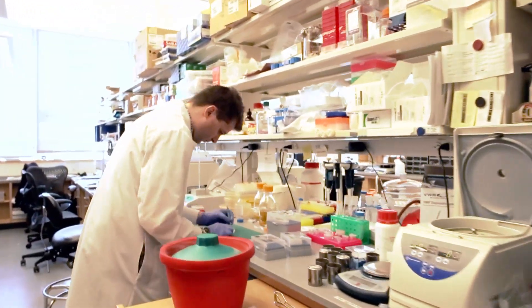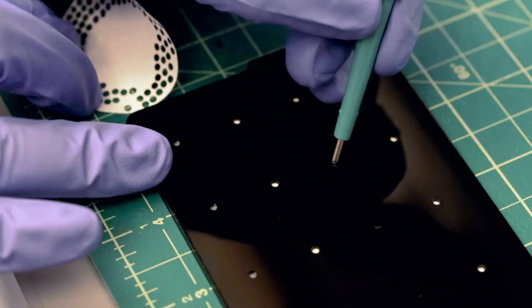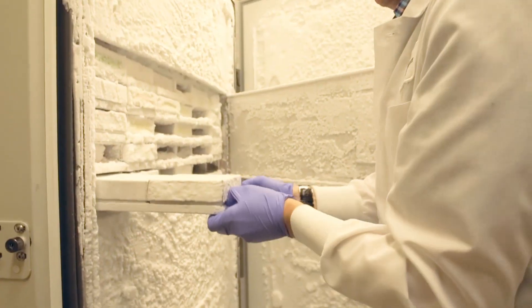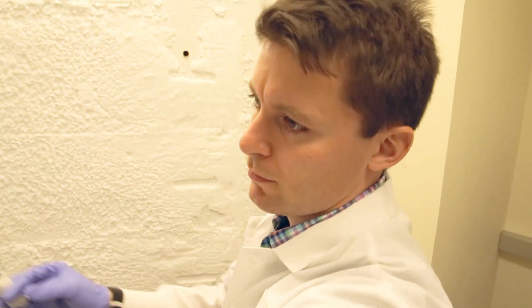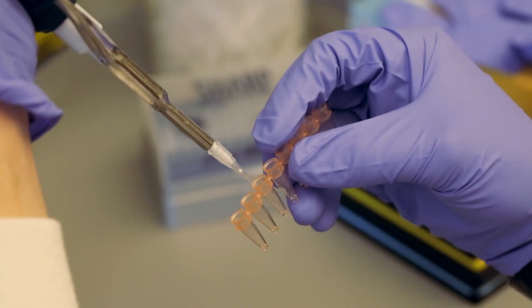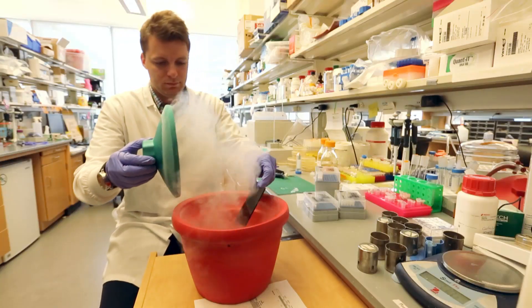That solution is paper. Each one of those small dots can be used to test for Zika. Here's how it works: the researchers take samples of the virus and infect live cells in the lab. They then remove a section of that infected cell, add it to the paper, and freeze-dry it.